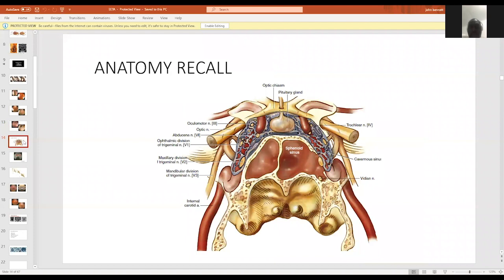Okay, this is a coronal view that helps you understand the arc that I'll show you. Both arcs will make a kind of M letter. So when you see those arcs, the sphenoethmoidal recess, lower margin, you should understand that just after that, you will get into the sphenoid sinus. And when you get into the sphenoid sinus, you should understand that laterally are the ICA, the cavernous sinus, V1, V2, and all those nerves that you will find laterally. But this is just something that you have to bear in your mind.